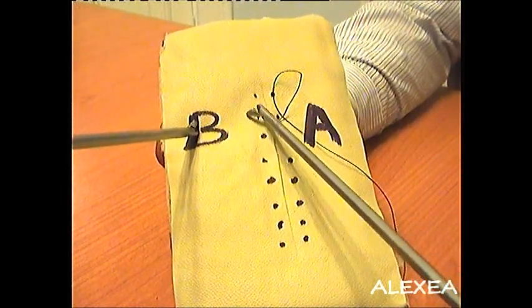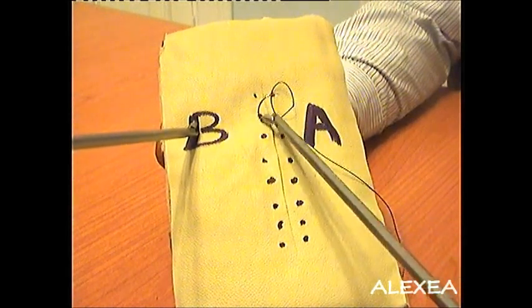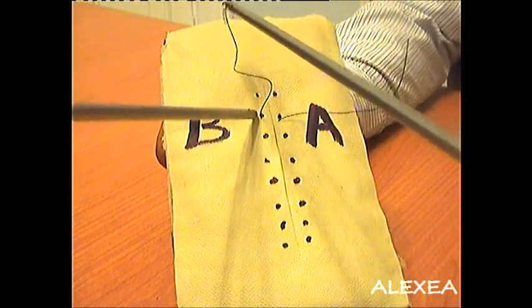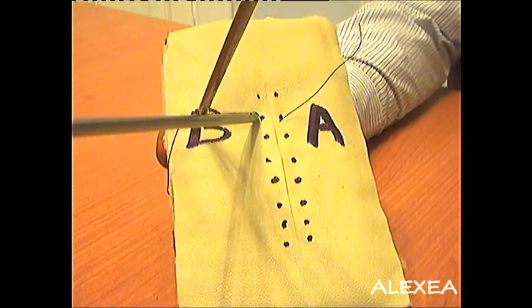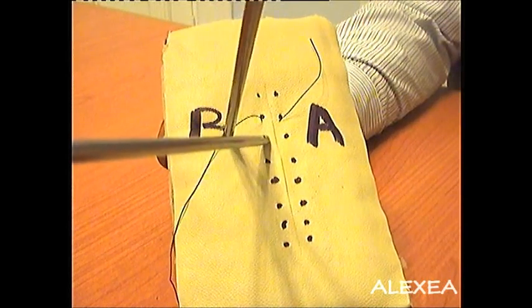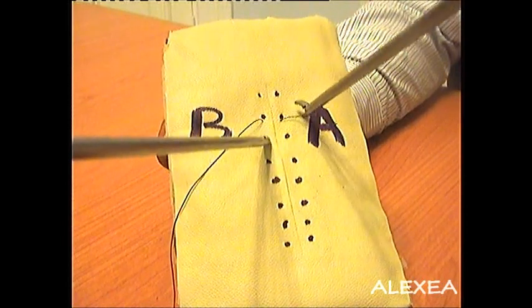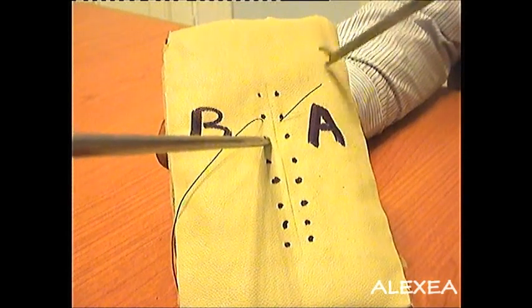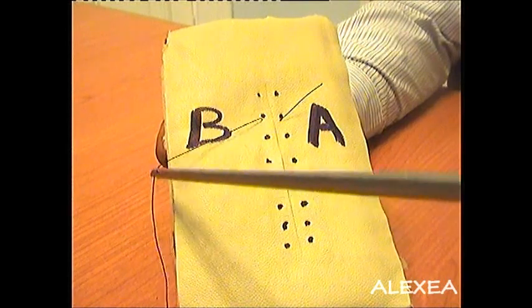Keep it with the curve of the needle so that you get the benefit of easy sliding of the stitch. Support the thread with the instrument on side B and gently pull the long end to a level that the short end on side A is approximately 2 centimeters in length. In keeping it at 2 centimeters in length, one will see that suturing becomes significantly easy.